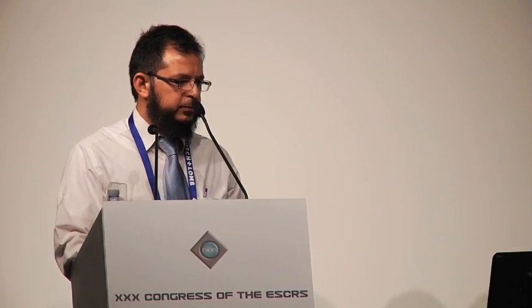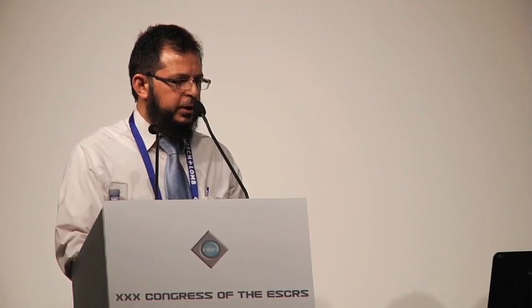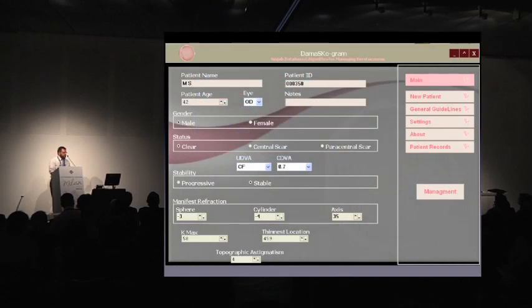I'll show you two examples in this software. We have a window to input the data of the patient. We have a 42-year-old male patient coming for his right eye. He has a clear cornea and a stable case. His unaided distance visual acuity is counting fingers, and the best corrected visual acuity is 0.7.